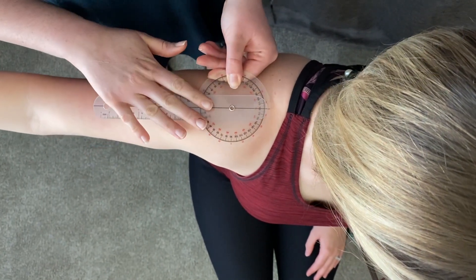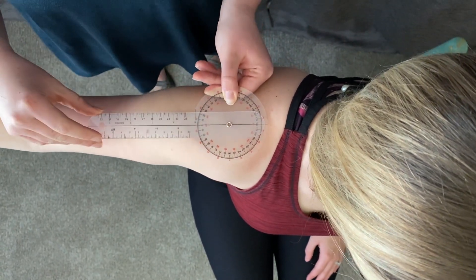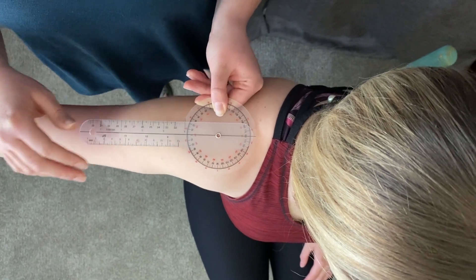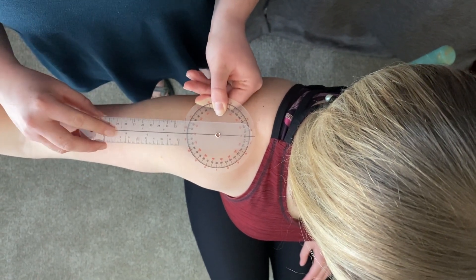You're going to start with the goniometer closed. The stationary arm is going to be parallel to the floor and perpendicular to the trunk, and the movable arm is parallel to the humerus.